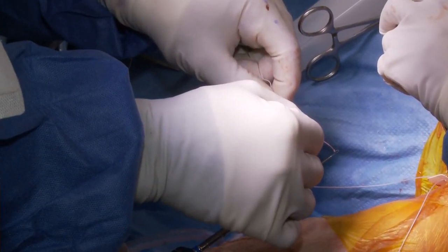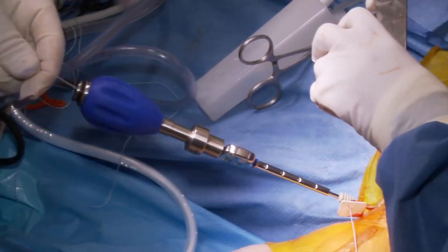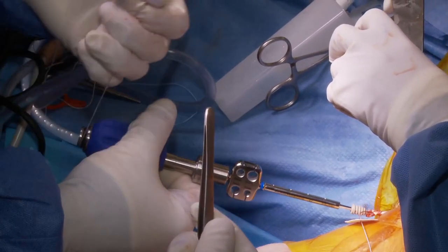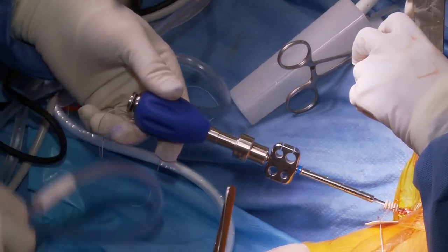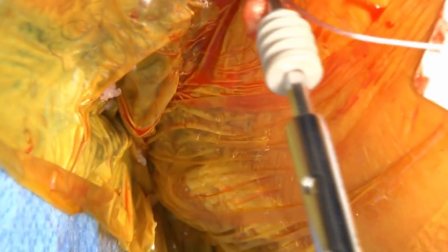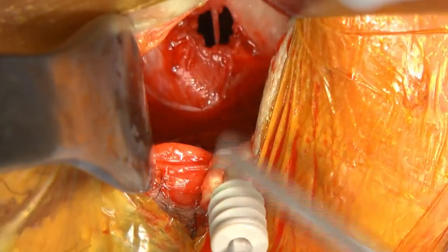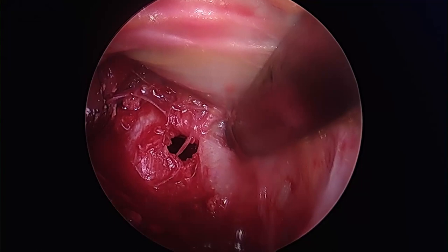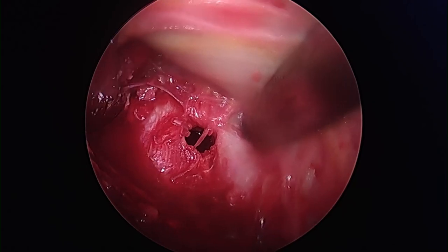Okay, and then pull on the wire, as you pull forward. Yep, great. Okay, good. And then we'll lock this in here. And then I need Adson pickups. We'll lock this on the O-ring, maybe. We'll clean out the suction here. We'll get our scope working. You're gonna do this, Chris. So I need you to clean that there and just hold it right like that, right? Is that good? Okay, so then I need Adson pickups. You just worry about that. No, I got the rest. I've gotta work around you, so hang on a second.